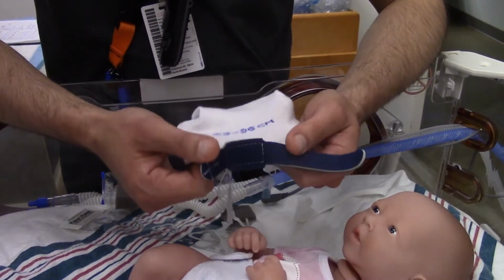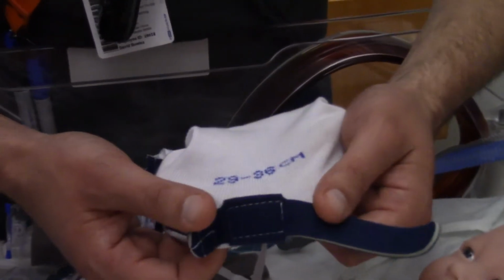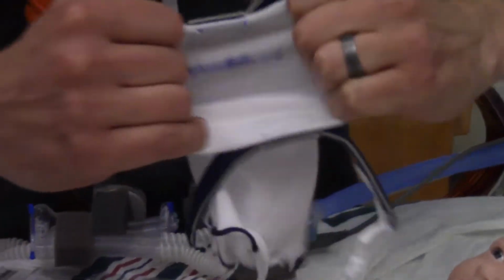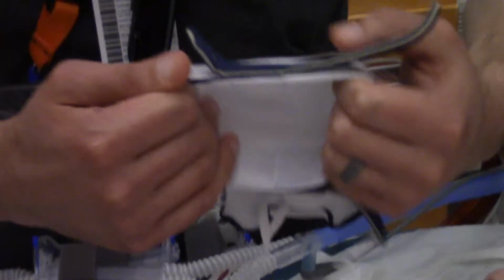Now next, we have these bonnets now, and we did only have headgear. These bonnets are really, really useful because, as you can see, 29 through 36. So it gives you a range. They stretch really easily and you can fit them over the baby's head. They will come out tight, so don't be afraid to stretch.